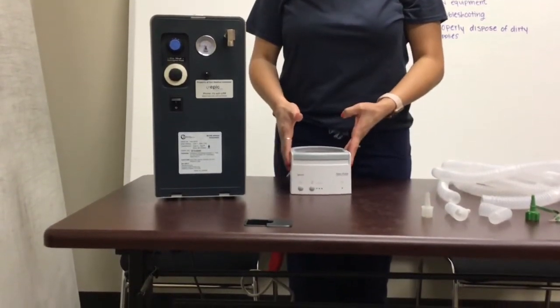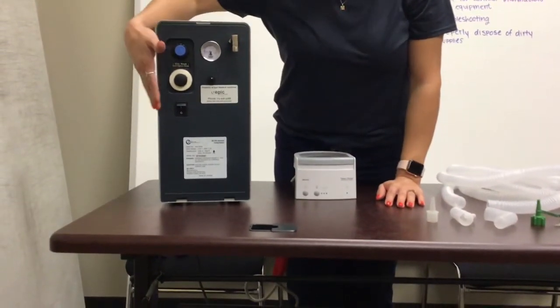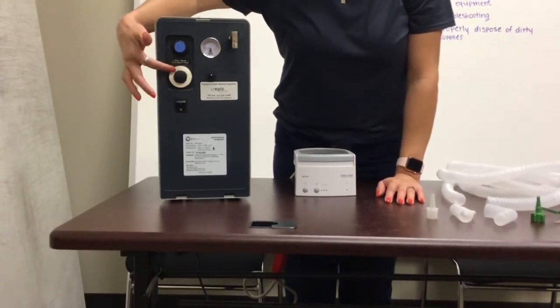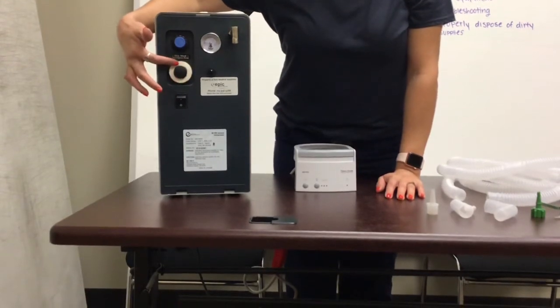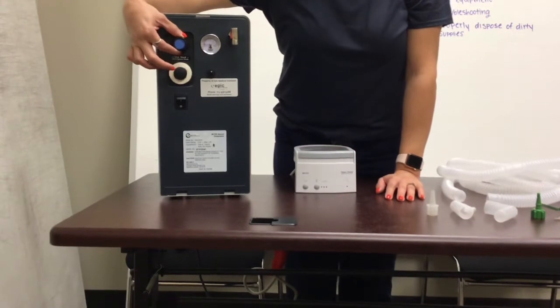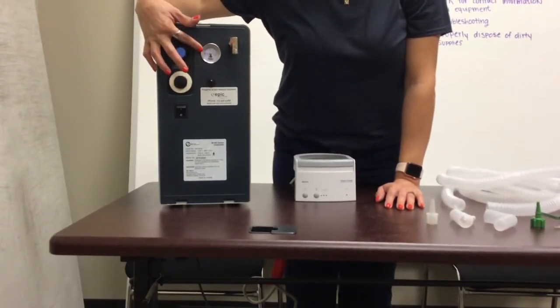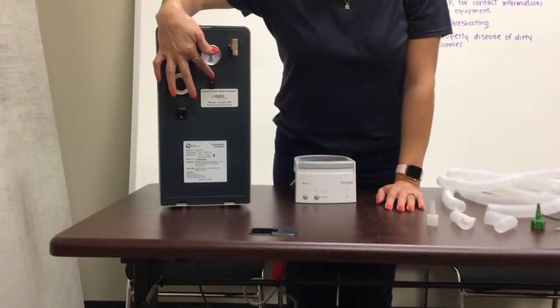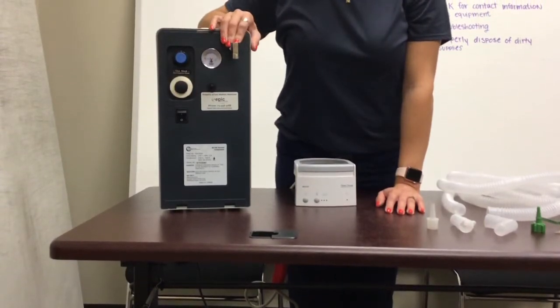This clip will be showing you what you will be seeing on your 50 psi compressor and your heater that will be delivered to you. First, we will go over your compressor. In the front of your machine, you will have your on and off button. Above this will be your filter, also called a donut filter, which will also be provided to you. Above that will be your dial to adjust your pressure if needed. This will be your pressure gauge where you will be able to see the pressure when adjusting the pressure. This will be your reset button in the event of a power outage and your compressor connector.